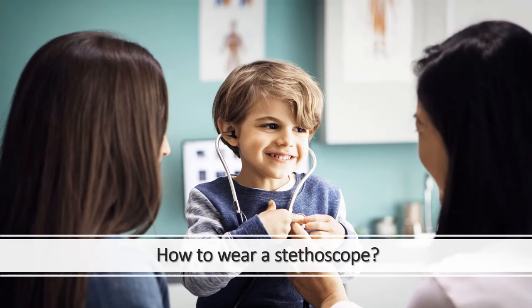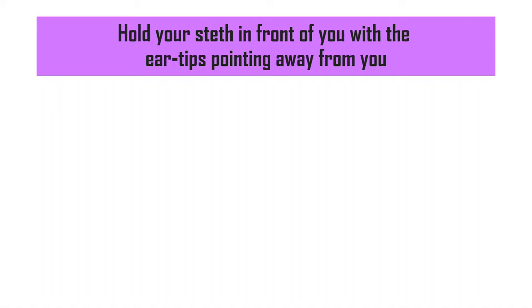Let us learn how to wear a stethoscope. The first step to wearing a stethoscope the right way is to hold it in front of you with the eartips pointing away from you.